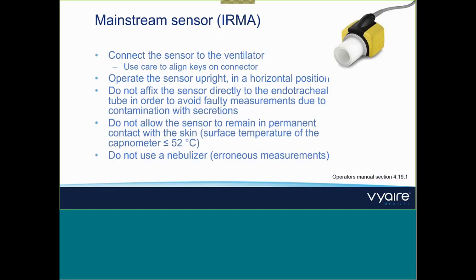So working with the IRMA sensor, which we are using, always operate the sensor upright.